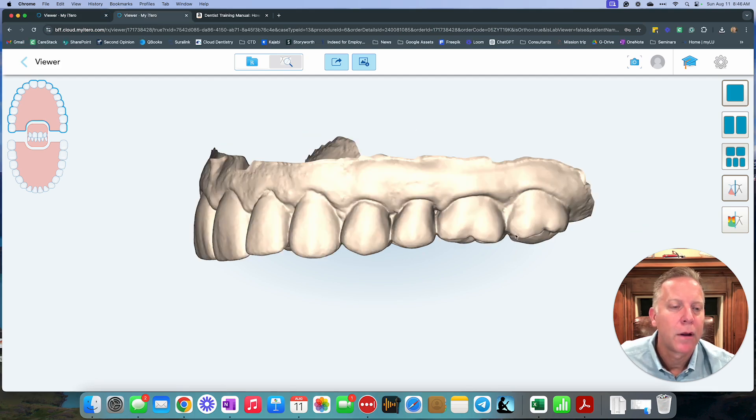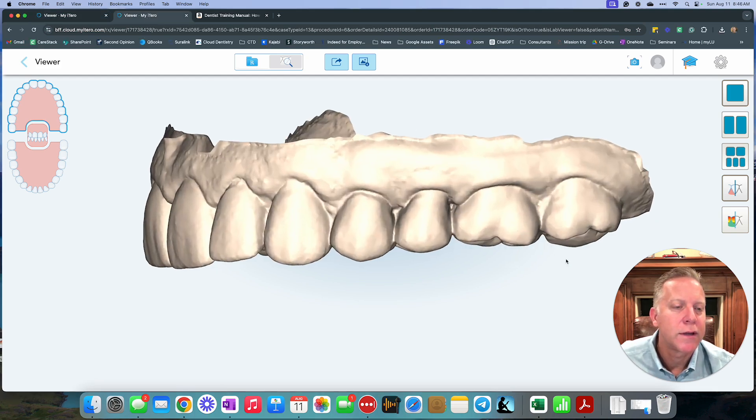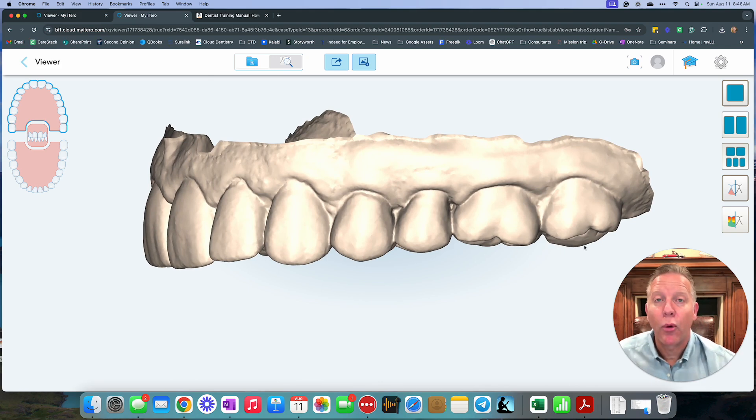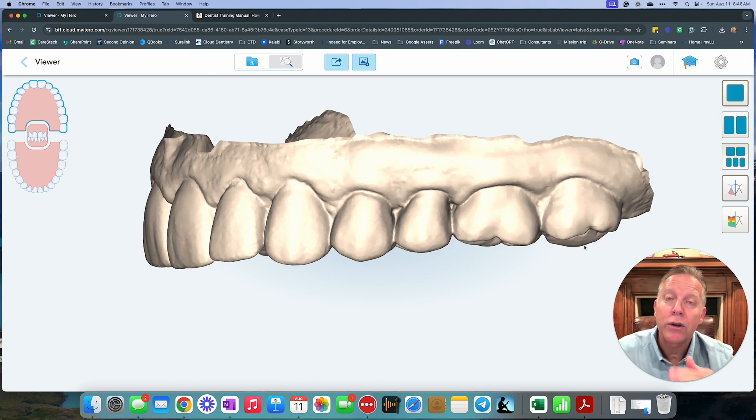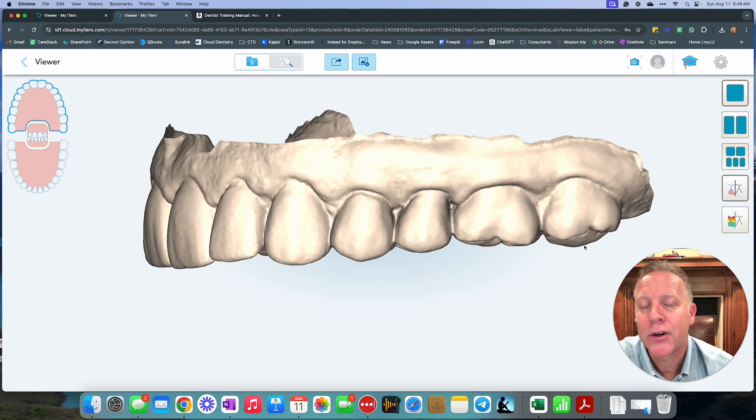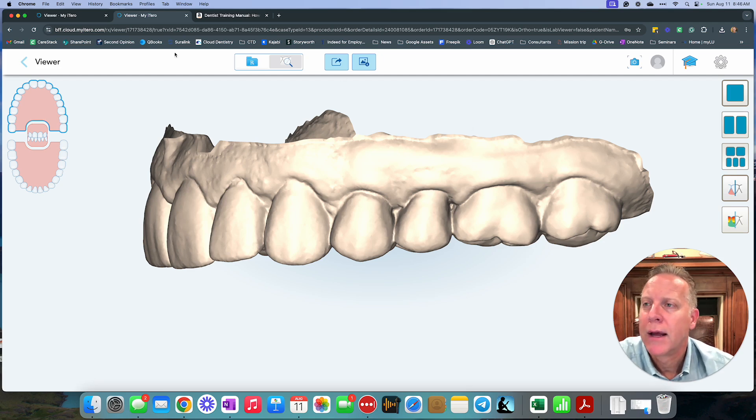Here's the after. So now you can see afterwards, that pointy part of that cusp has been reduced to lower the amount of pressure that's on the lower tooth.